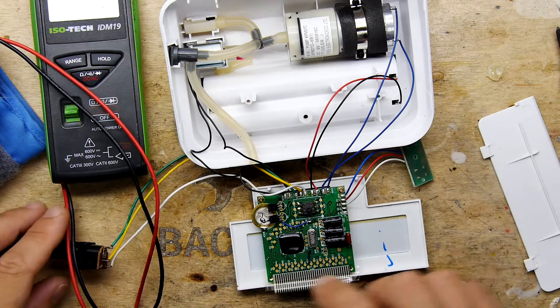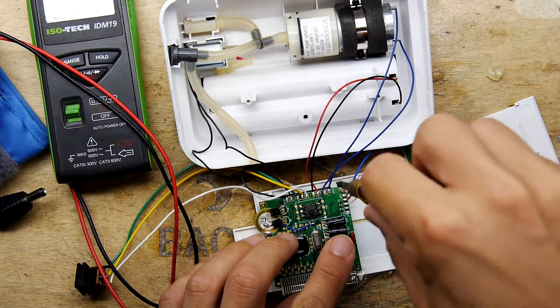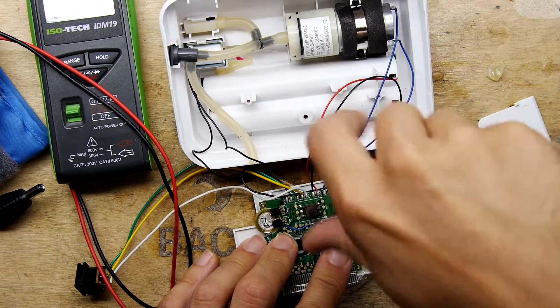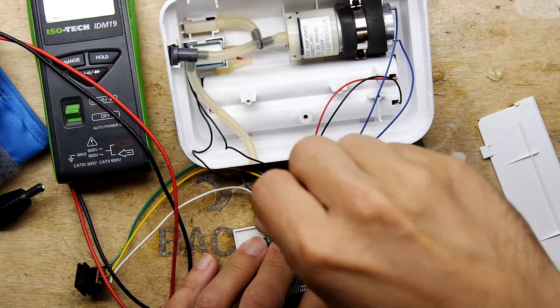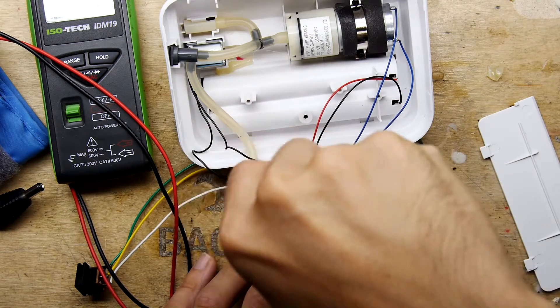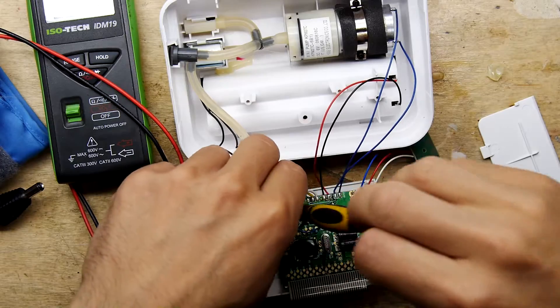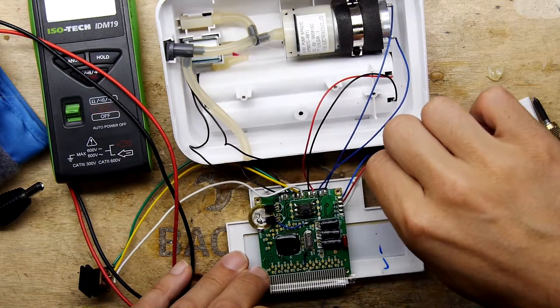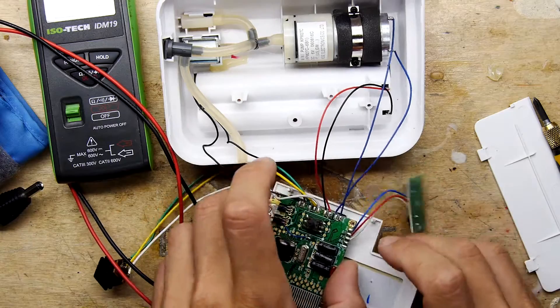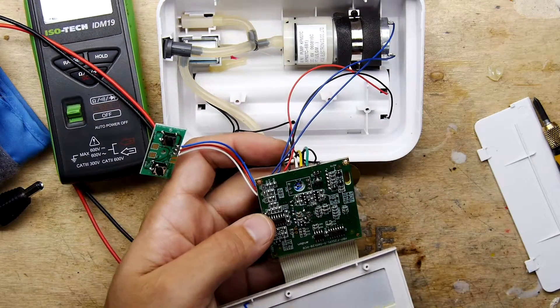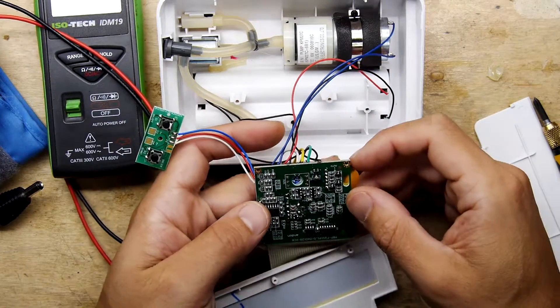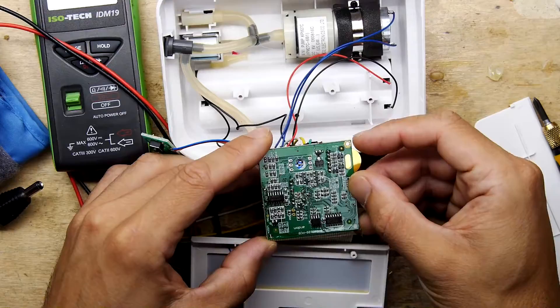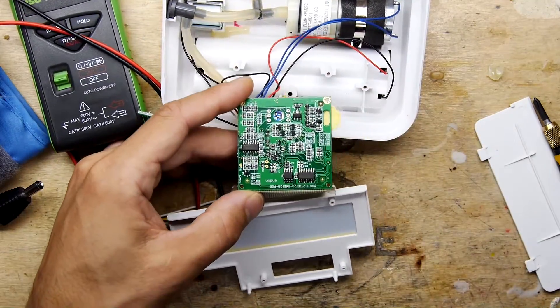I might just pop off this circuit board now because remember we said on the back there was nothing but passives. One of those things might be a fuse. So let's have a look. I mean, that could be a simple fix. Because if you imagine something like this, which has got motors and solenoids, it could be a scenario where it could have quite a high current. And it does make sense that there could be a fuse on here.